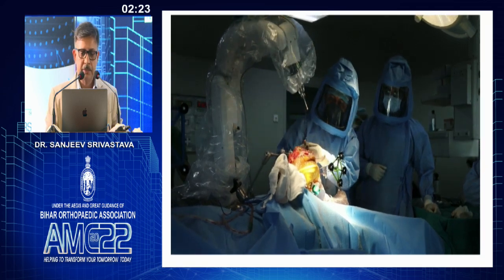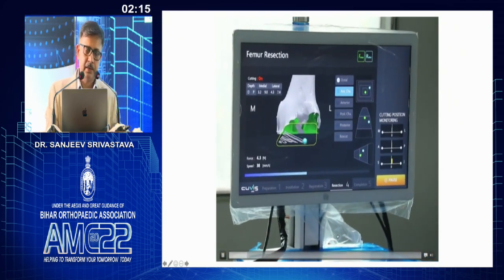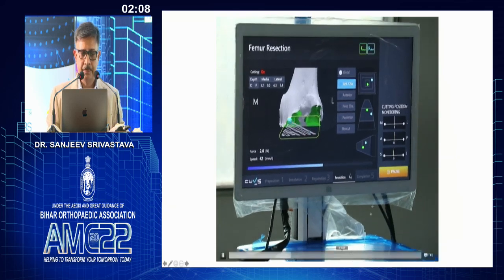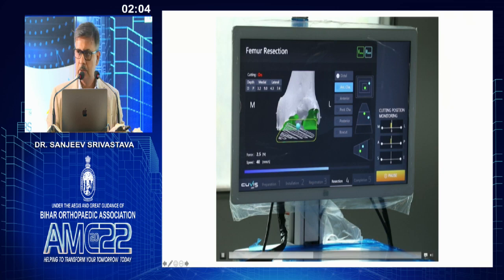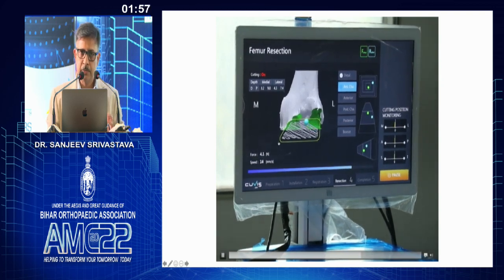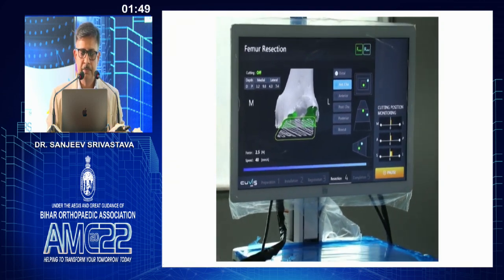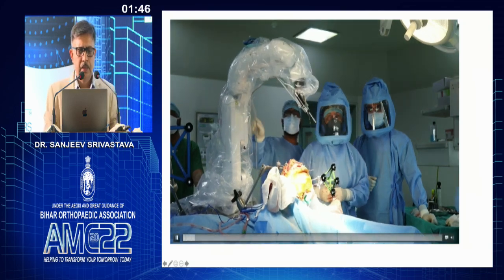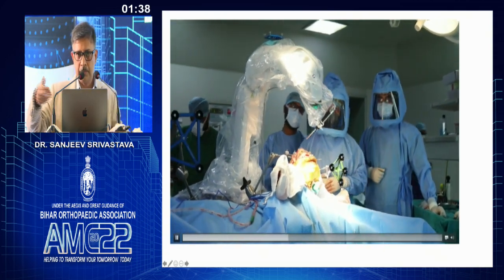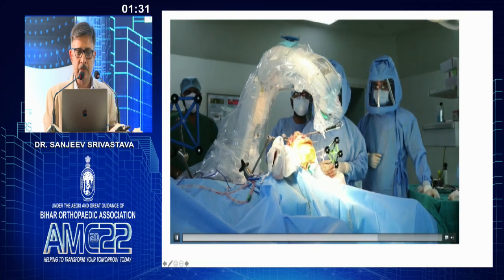Someone was asking about the synovitis part. Because it is constantly being bathed with the saline, the chances of synovitis is quite less. And in fact, it also prevents the damage due to heat generated. So it constantly shows you the real-time image of how the burr is moving. This boundary is set by the software itself, which understands the bony boundary according to the CT scan, and the surgeon can also move this boundary. This arm can move in 6 axes. So it can also take the cut posteriorly without causing any damage to the soft tissue. You just have to make sure that these arrays are not coming in the way of this milling tool.